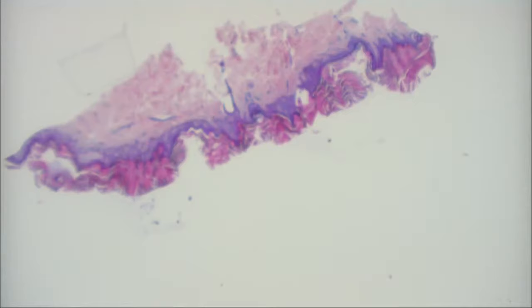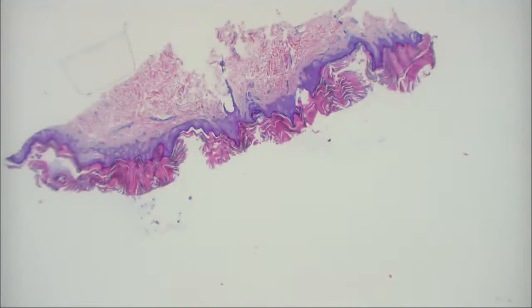But what if this was present in a widespread fashion, like over the trunk? Maybe we can show them a picture of it. Yeah, what if it looked like this? Oh, that almost looks like, you started to say it. Is this terra firma-forme dermatitis? It could be that, but if you look at terra firma-forme dermatitis, it doesn't really give you the digitated epidermal hyperplasia.